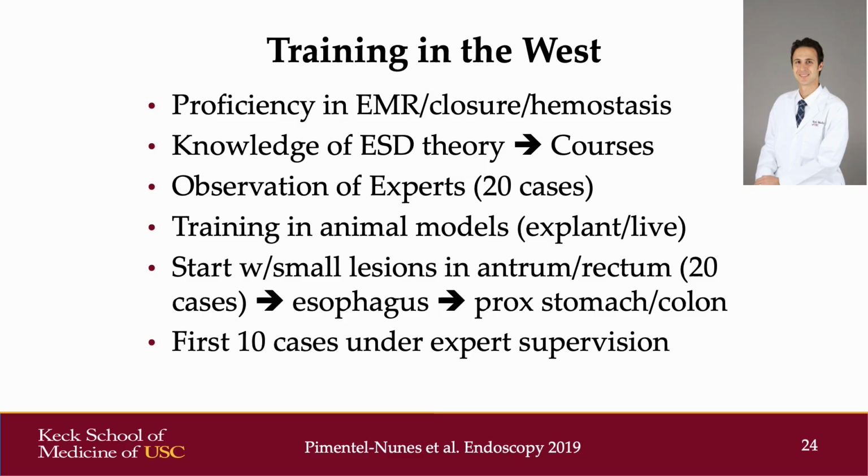Initially, it is preferable to start with small lesions in either the antrum or the rectum, approximately 20 cases or so, and then move on to the esophagus, and then the more difficult areas of the proximal stomach or the colon. The first 10 cases should generally be performed under expert supervision.